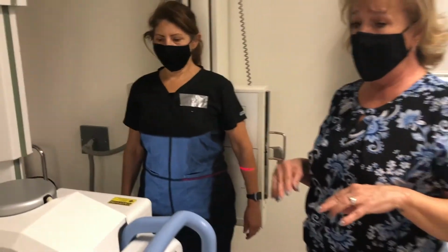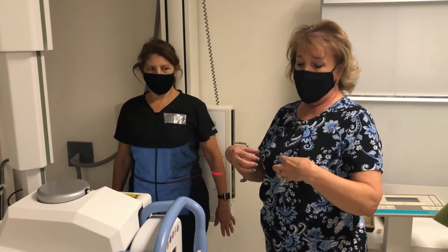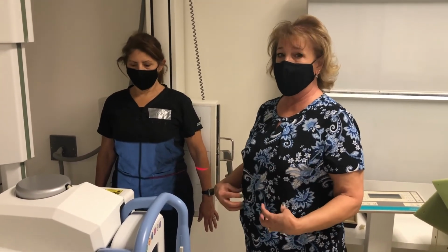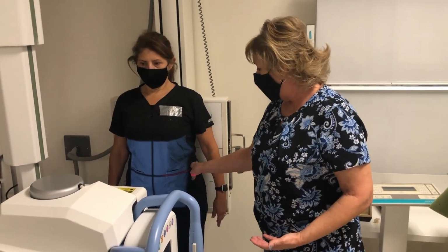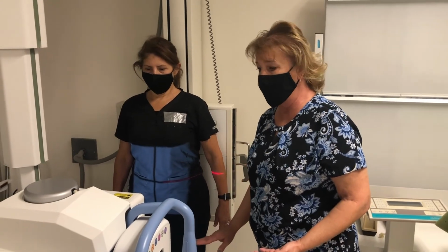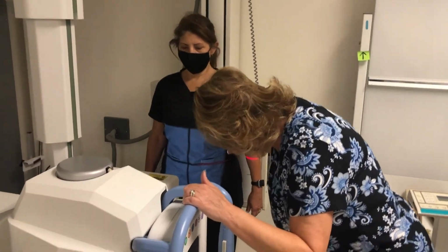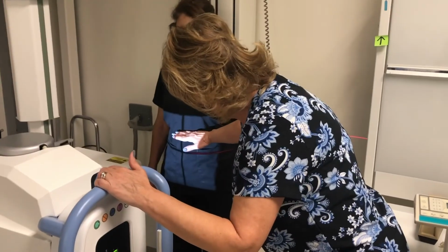So at this point, I might even send her an inch below the top of her crest, because the book talks about how between supine and erect, the kidneys can travel as much as 5 to 10 centimeters. So I know her kidneys have dropped a little bit. They're closer to her bladder now, and I have to get the bladder. The post void has to include that. I wouldn't want to have to go back and do a separate bladder shot. So I'm going to send her maybe just an inch below her crest so that I'm sure I've included her bladder.